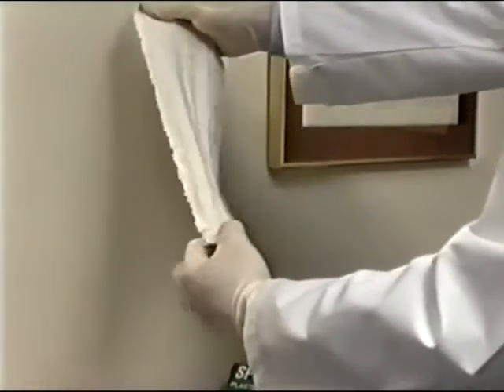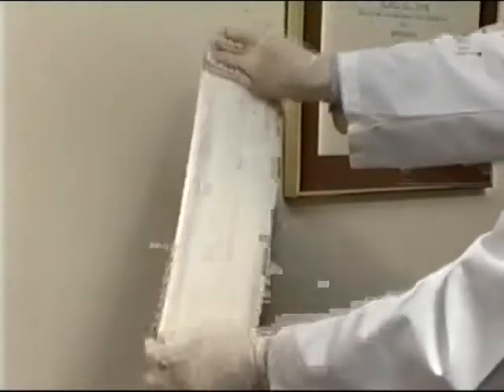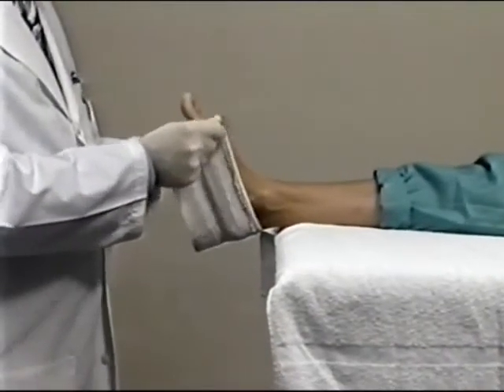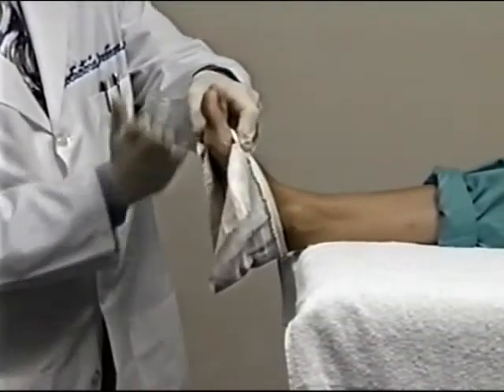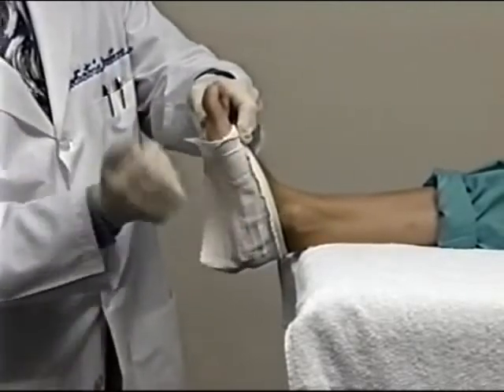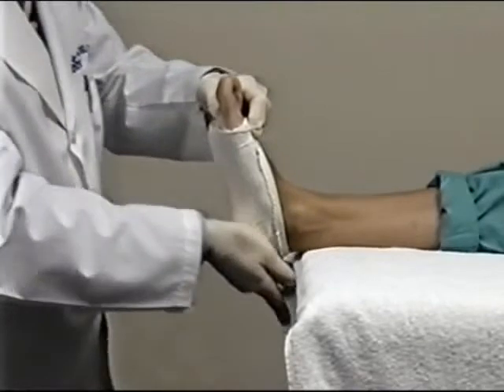Unfurl and fold down the distal half-inch of the plaster splint to add strength to the finished cast. Apply the first splint high on the back of the heel over the first and fifth metatarsals and to the bottom of the foot, one side at a time.